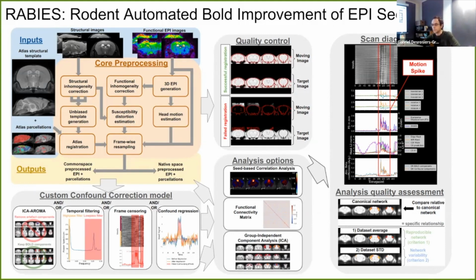This is divided first by a scan level observation approach, followed by a more group level statistical report that I'm going to cover later.